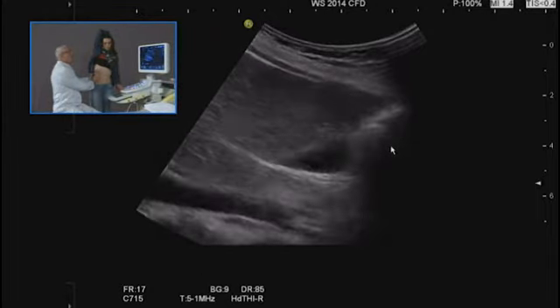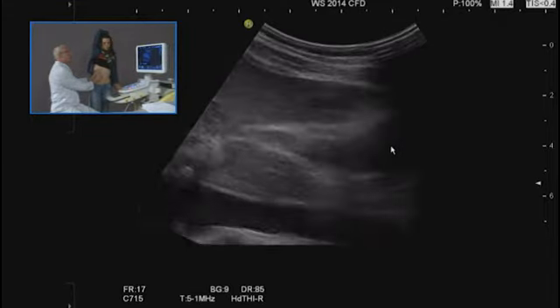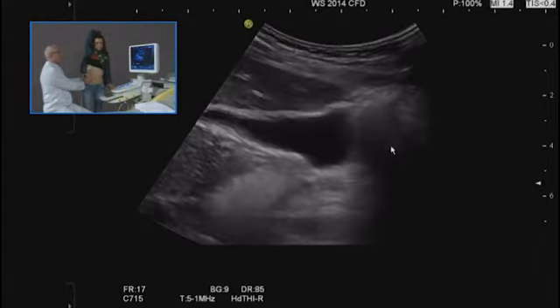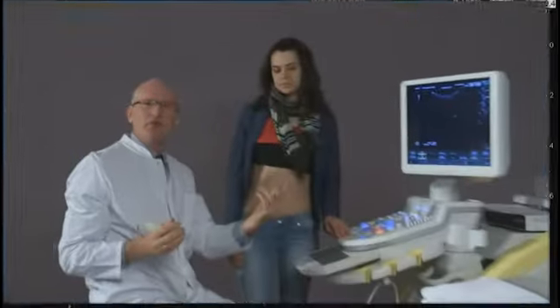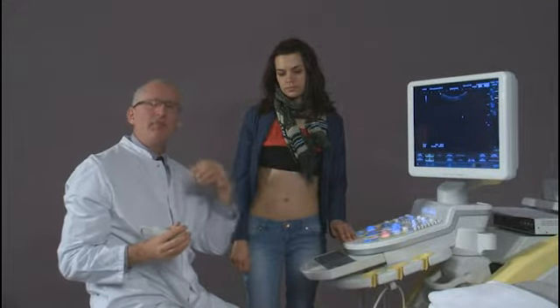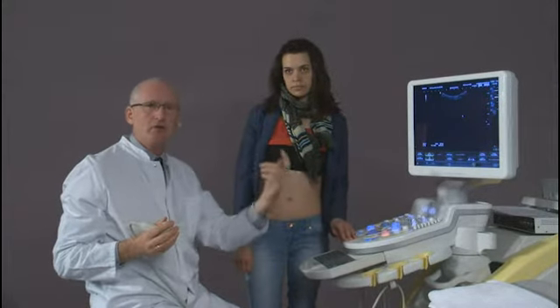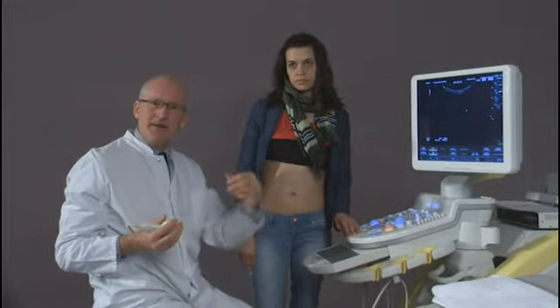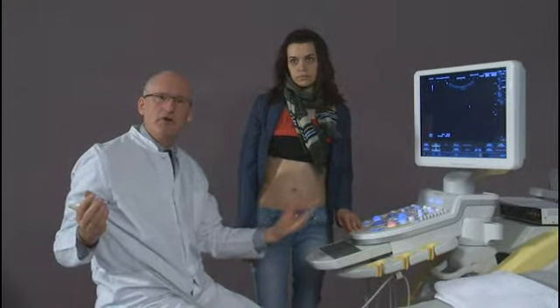In the standing position, we start the longitudinal and transversal orientated examination. And additionally, we perform some vibrations to delineate mobile stones. It is of importance to examine also in a standing position in patients without known stones for better visualization, and for stones detected in the infundibulum to characterize if those stones are mobile.